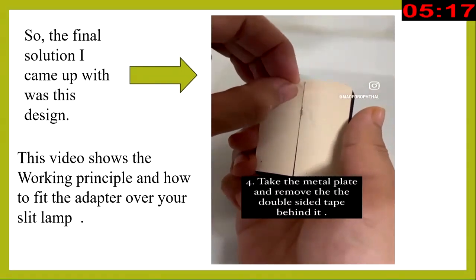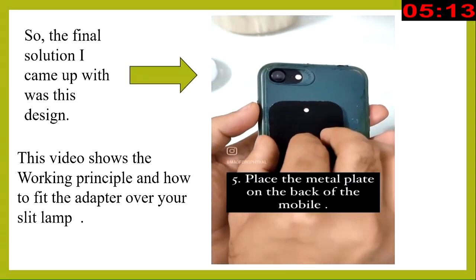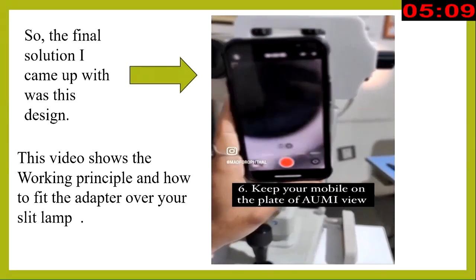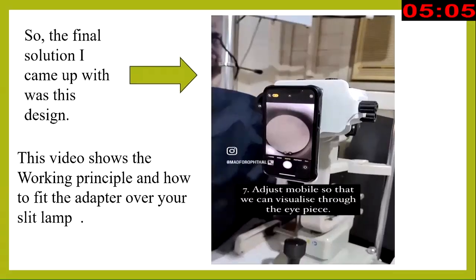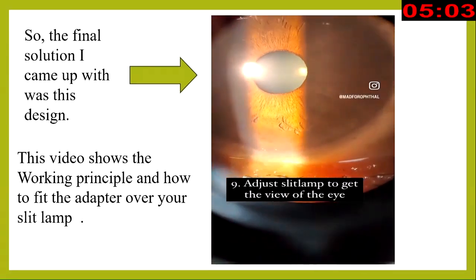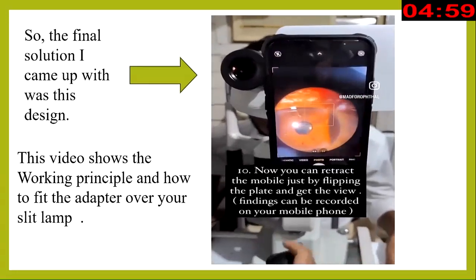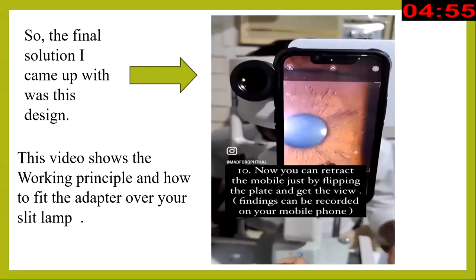Now this is a metal plate which we attach behind the mobile, and we have attached a few magnets in the adapter, so your mobile automatically sticks to the adapter. Once you get a good focus, you just flip it back onto the eyepiece and you can use the slit lamp and even record videos.